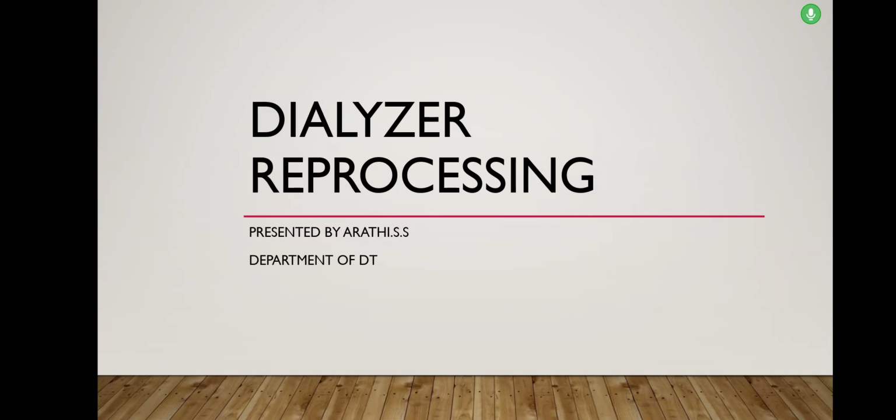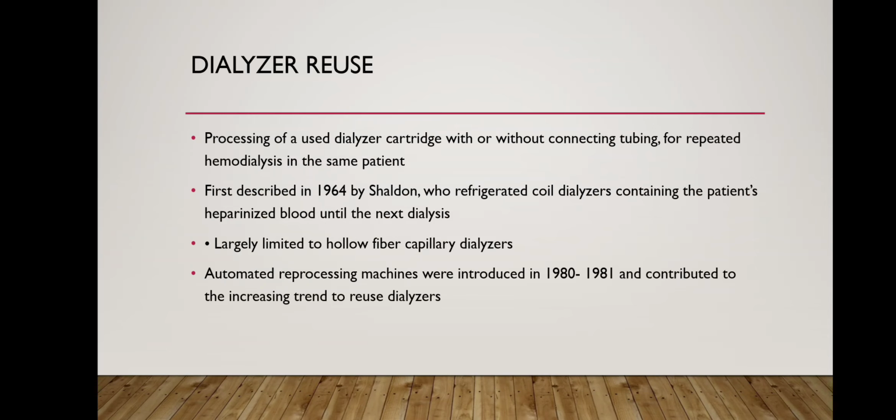Hi everyone. Today we are going to discuss dialyzer reprocessing. First of all, dialyzer reuse.